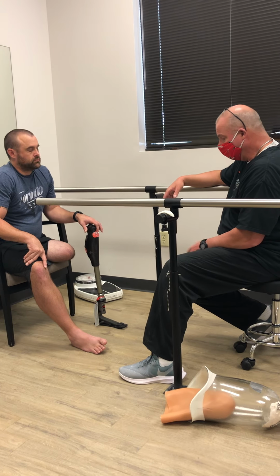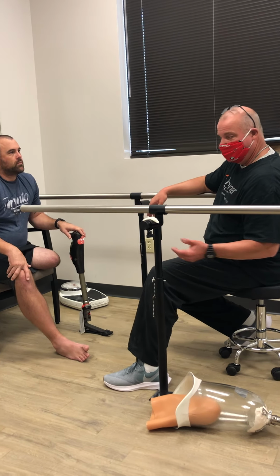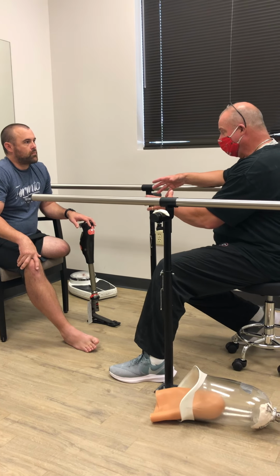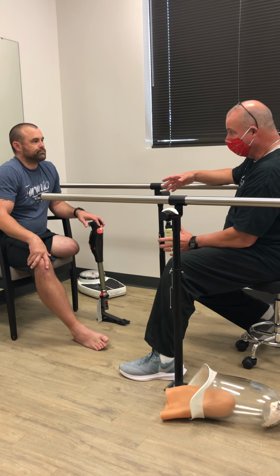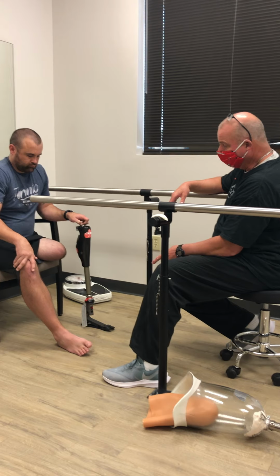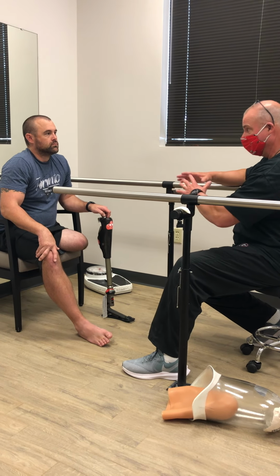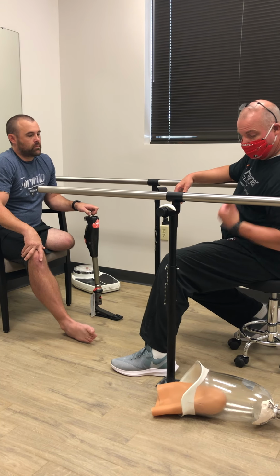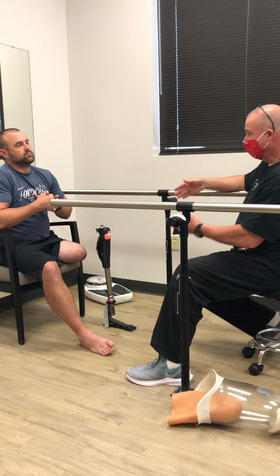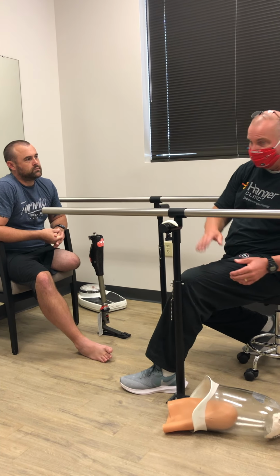Hopefully 3 check sockets. I've also seen you at similar times of the day, but you fit consistently in all 3 of them. I know you've been wearing shrinkers since like day 1. I haven't seen you swollen. I've seen your ankle swollen, but outside of just the ankle, you look pretty consistent every time you come in here. So am I worried that you're going to have a big fluid problem? No, I've seen you 18 times. You've looked pretty consistent all the time, so I'm pretty confident that we're in a good place to move ahead.